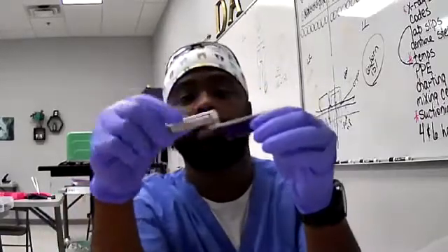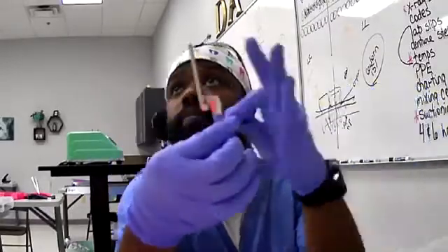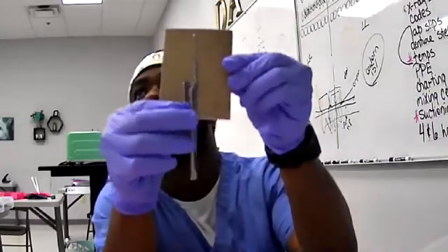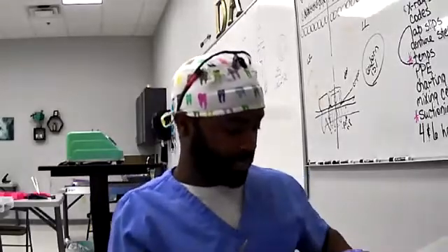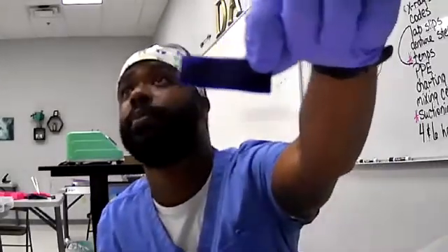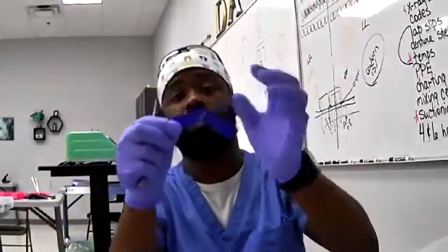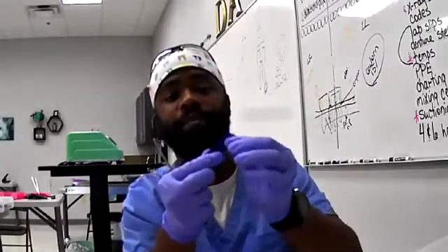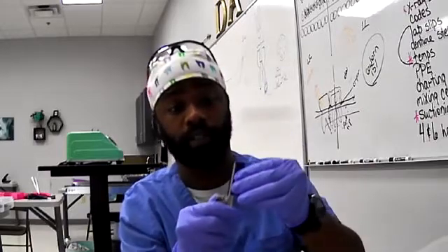Okay. So this is called the articulating paper holder. Can you really see what this is? Kinda. Okay. But it's an articulating paper holder, and this little thin blue piece of paper, which comes in blue and red, is called articulating paper, and it's just a super thin little piece of paper, but it checks the bite of the tooth. So it'll check the occlusion, the biting surface of your teeth.